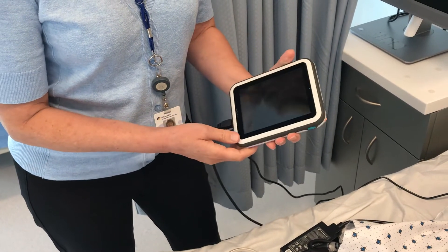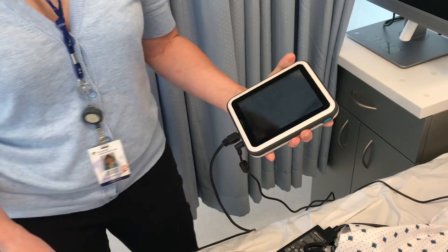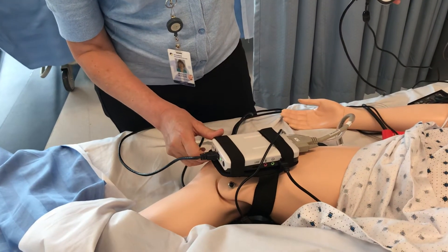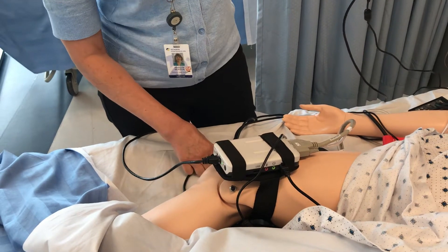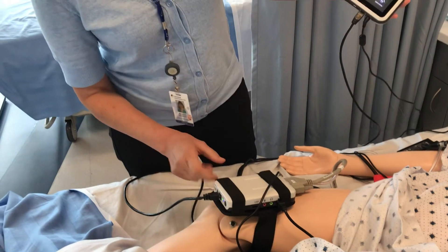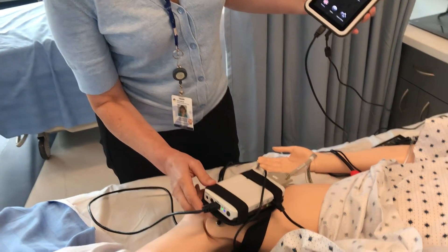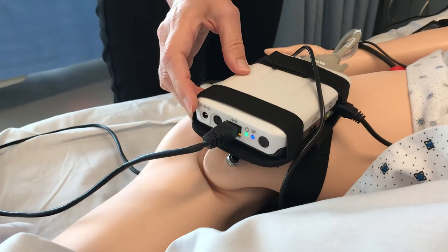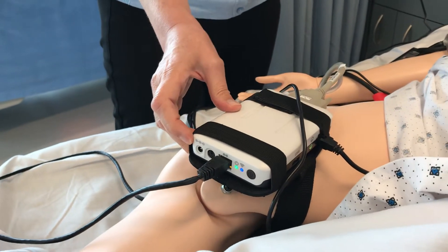I'll turn that on. The green light is flashing. And on the link box, the green light is flashing, so we're going to wait a minute. On the link box, you'll see I've got a blue and a green light, which indicates connectivity.